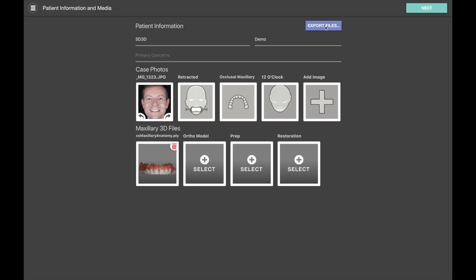On their side they can basically push this button and export a folder containing all of the patient photos and intraoral scan files that you've attached to the case. So it's an easy way to move 3D data around as well as collaborate with the team.